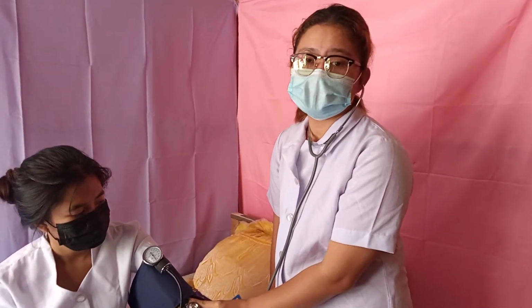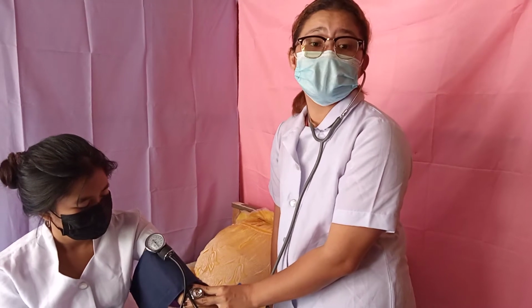After that, palpate the brachial artery, turn the valve clockwise to close the compressed valve, and inflate the cuff to 30 mm Hg above the point where the palpated pulse disappears. Rationale: to get accurate results.